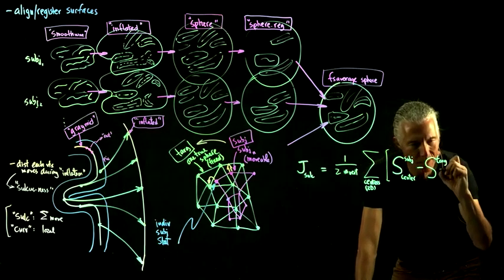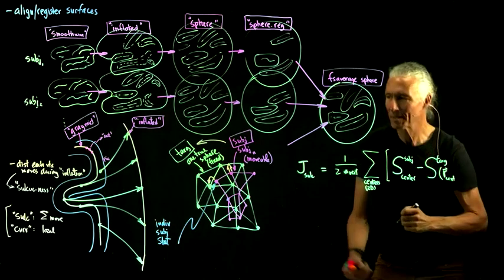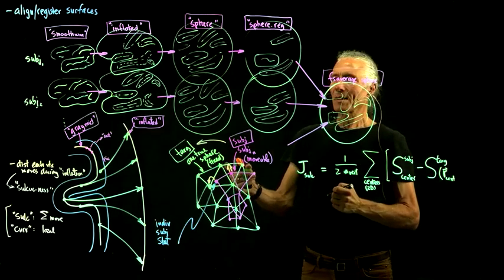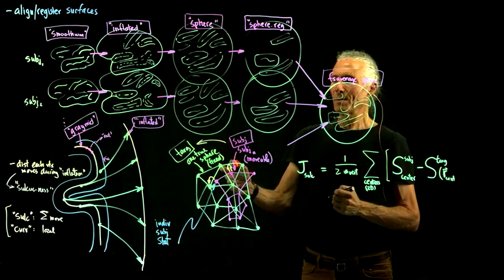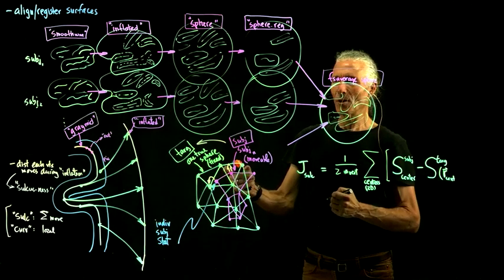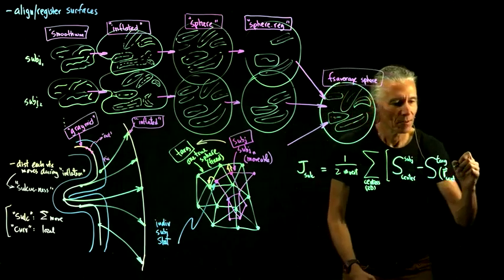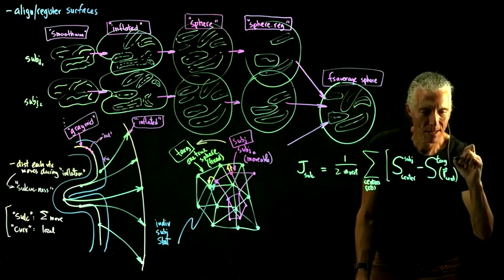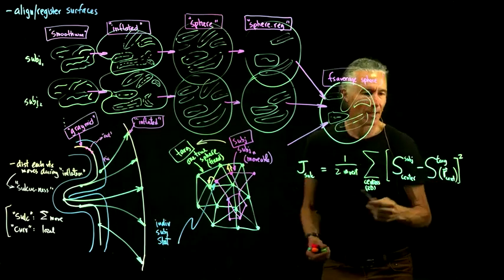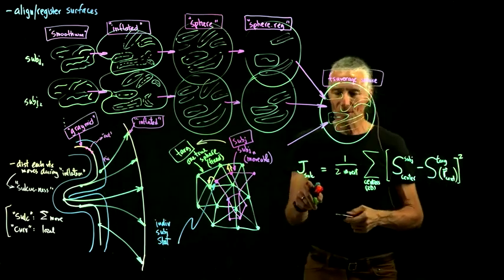And this one, for the purposes of the derivative, is going to be our variable. Because we need to go in whatever direction will make our sulcousness more similar to the target. And so that means we've got to go out in space a little bit, take a derivative, and go out in space a little bit to figure out which way to go. And so that one's the variable for when we take the derivative, and then squared. Now that's just one term.